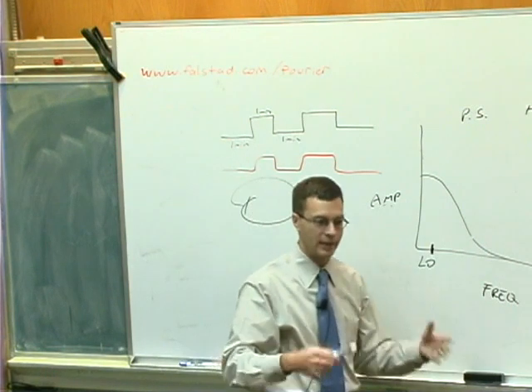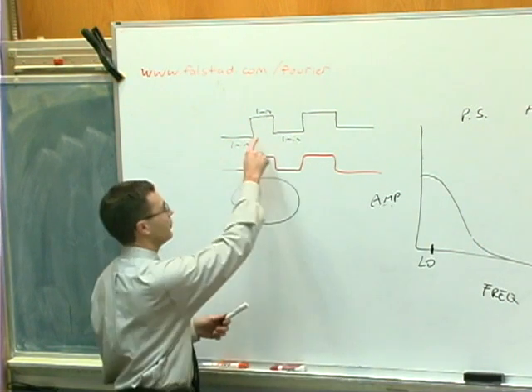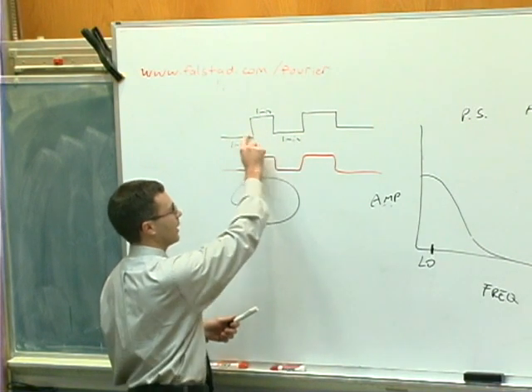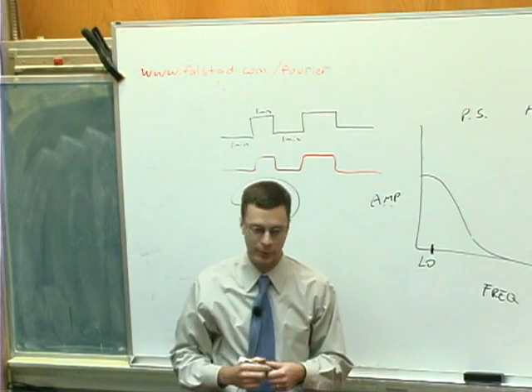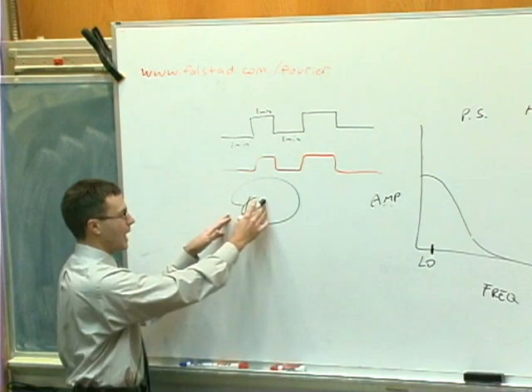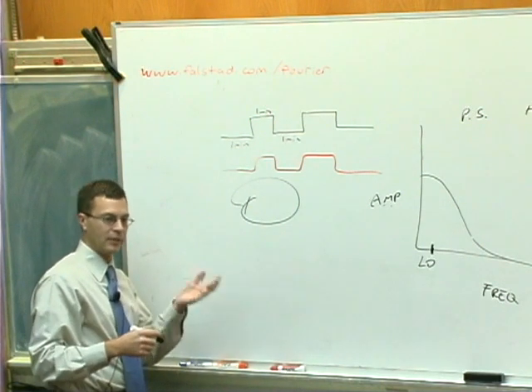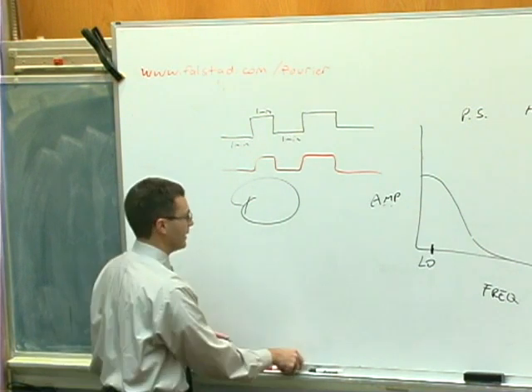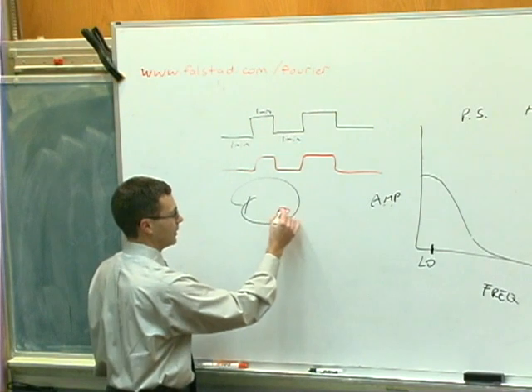And then I looked at every voxel in the brain, and I said, okay, is there a significant relationship between the change in the bold fMRI signal over time in that voxel and this predictor of what the signal might look like if it did have a difference between the two? And then I made this statistical map where at each point in the brain, I took a look at the t-value. And if the t-value is bigger than 1.65, say, I'll put a red dot. Okay, so they come up with a map that looks like this.